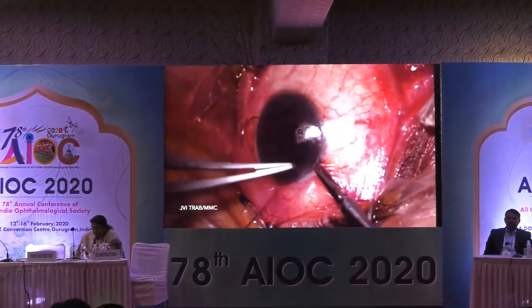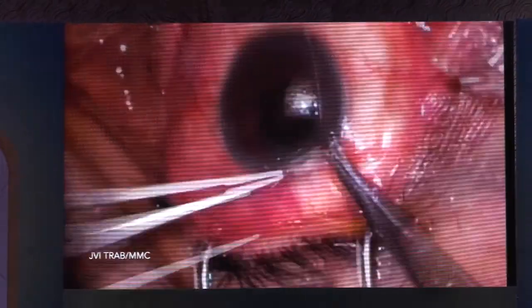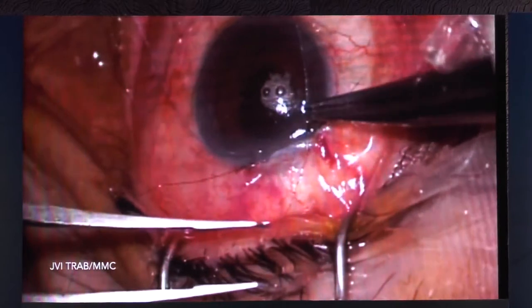So I use two wing sutures. I do purse-string sutures, and then I do horizontal mattress. We audit ourselves quite rigorously, so our leak rates are 3 to 4% per year because of the kind of efforts we take in closing our conjunctiva. And I think that is significantly lower than the TVT trial. But this is all audited data. It's retrospective, mind you, not prospective, so it could be underreported. So anyway, this is how I do a trabeculectomy.